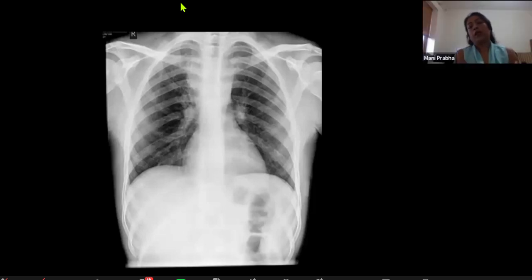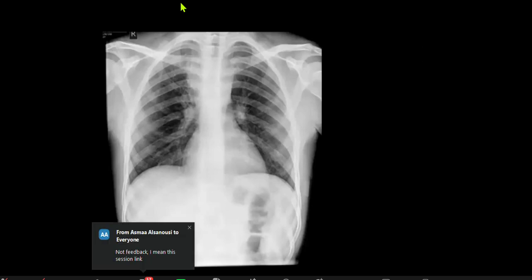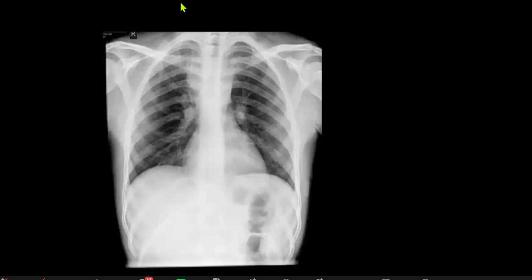Any radiological investigation you would like to consider? The patient may need cross-sectional imaging, although they're a child. Depending on the symptoms, if they have symptoms of TB with night sweats or weight loss, then I recommend a CT to confirm.